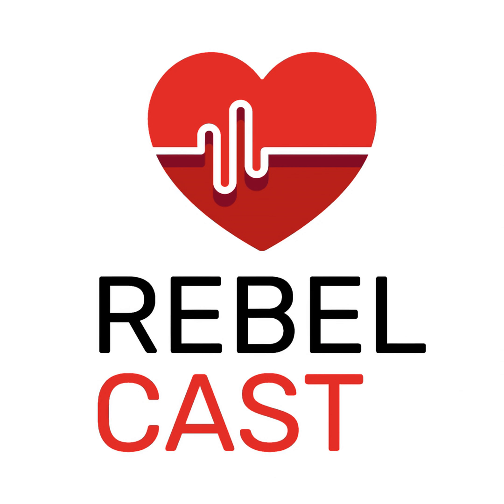One of the most common modes that we see is something people refer to as volume control. They'll say patient is on volume control. It's a little bit of a misnomer because really what they're on is assist control volume. And in that name, assist control basically tells you can take two types of breaths, assist breath or a control breath. And when that breath is being delivered, it's going to be a set tidal volume. So everything's in the name right there. Assist control volume, or people refer to this as volume control.